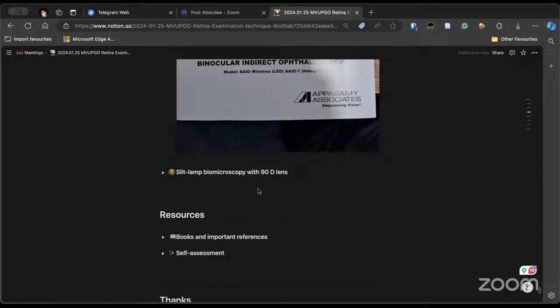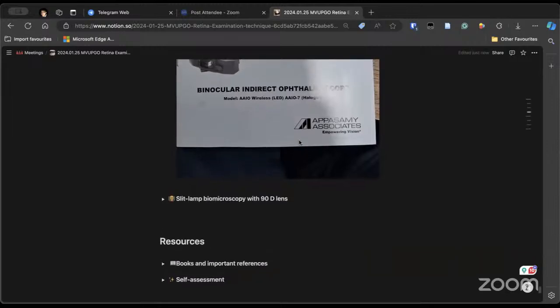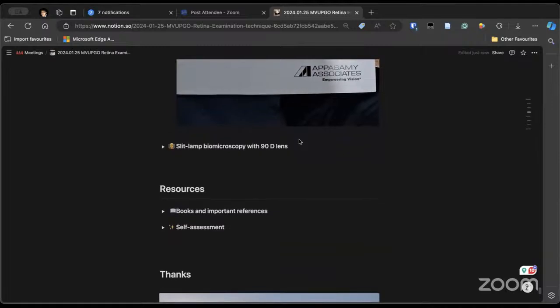Sir, you told us about examination of the vitreous. If such a question is asked, can we say direct with the +3 or +6? Yes, that is another thing. Direct with plus power can be used to examine the vitreous also. And if you are seeing through the slit lamp in a vitrectomized eye, there will be less vitreous in the mid vitreous cavity. There will be fluid. That will also give you clues on what has happened.